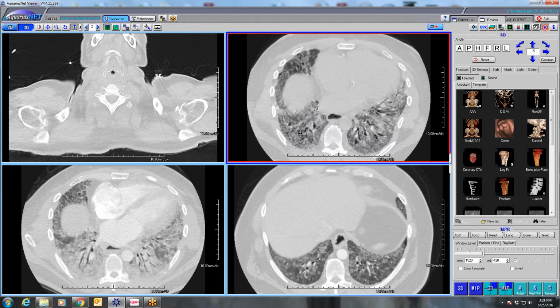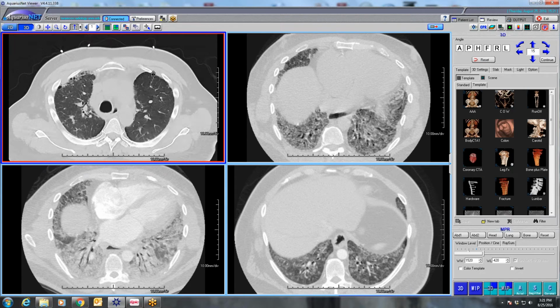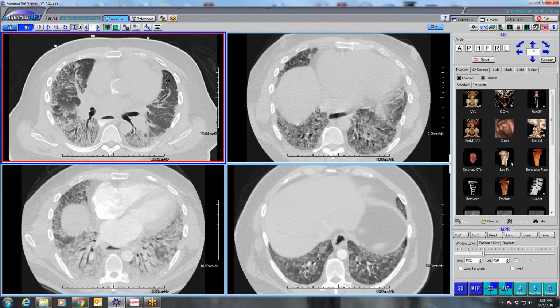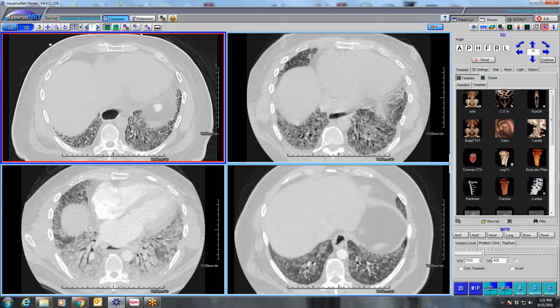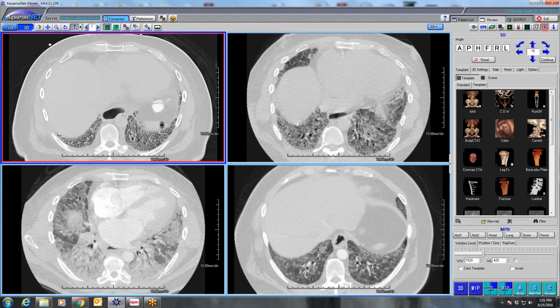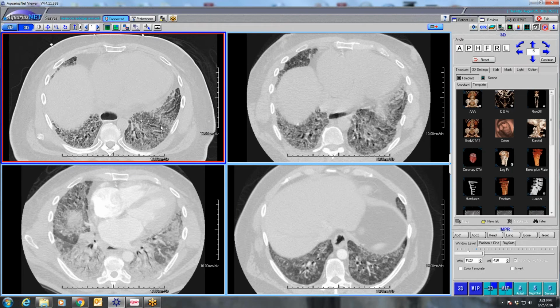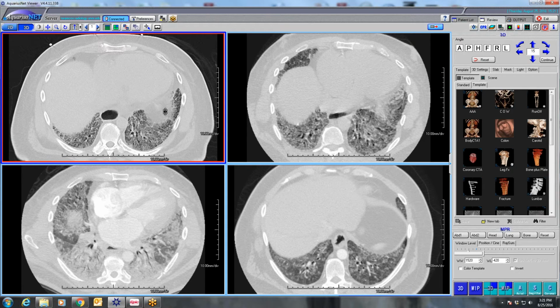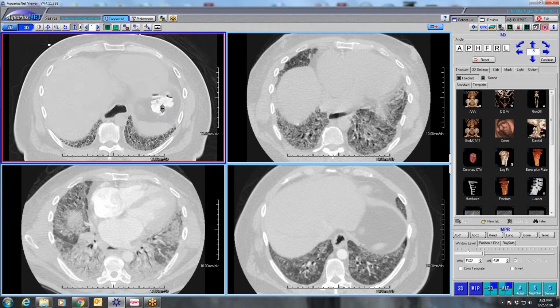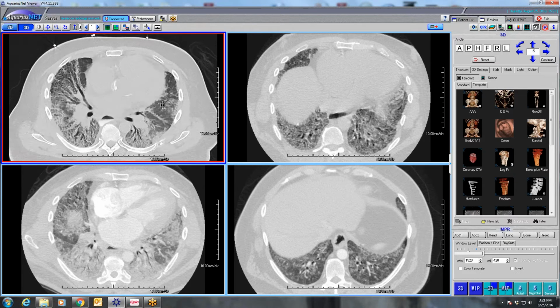And then what's just fascinating to me is how these progress over time. Eventually a lot of the ground glass is still there, but it's predominantly resolved, at least a lot of the more dense ground glass, even bordering on consolidation. And we're just left with this severely fibrotic process, and he undergoes lung transplant. And the final pathology on lung transplant is severely fibrotic NSIP with areas of organizing pneumonia.